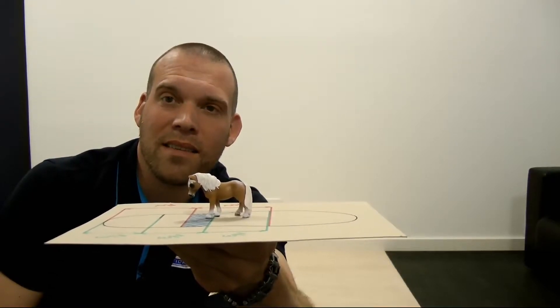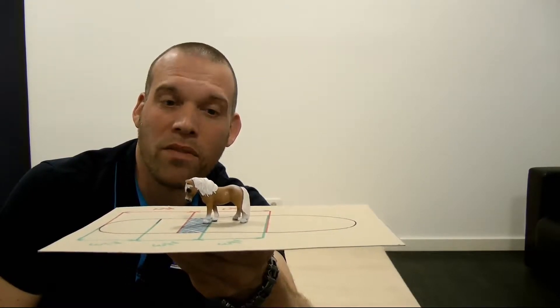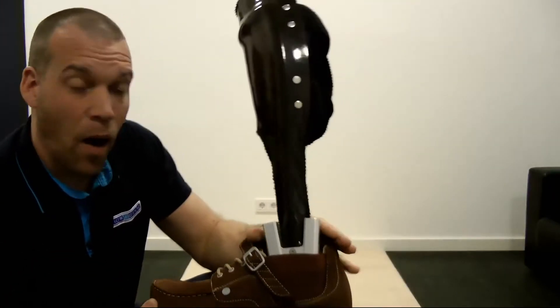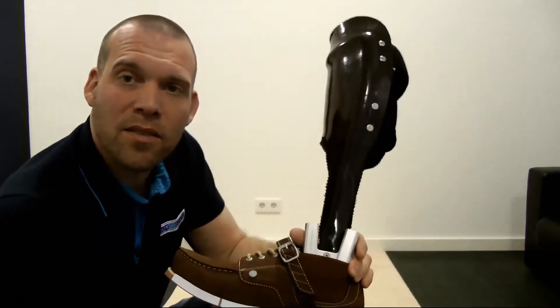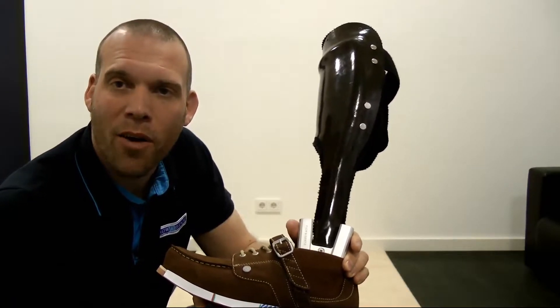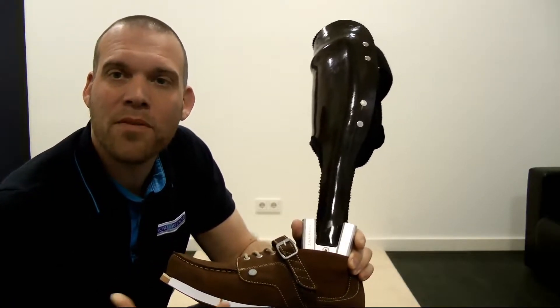How does it look when someone is standing on two legs? That is a little more complex, and for this reason we have given some thought to this. The alignment of an orthosis should, of course, be checked once on the workbench before we go to the patient and check the static alignment.